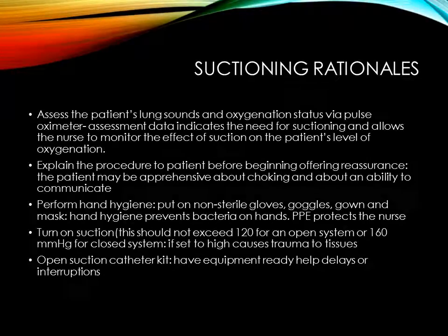Suctioning rationales. Assess the patient's lung sounds and oxygenation status via pulse oximeter. This assessment data indicates the need for suctioning and allows the nurse to monitor the effect of suction on the patient's level of oxygenation. Explain the procedure to the patient before beginning, offering reassurance. The patient may be apprehensive about choking and about inability to communicate.